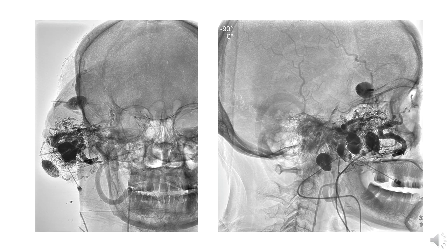Unfortunately, here we have to make 4 punctures. We can see on the lateral image that there are 5 such blobs. One of them was from the previous glue embolization, and for 4 we have attempted to inject contrast, but all of them were unsuccessful.